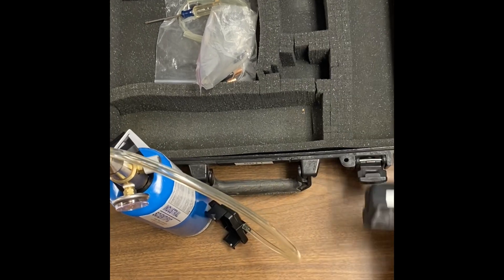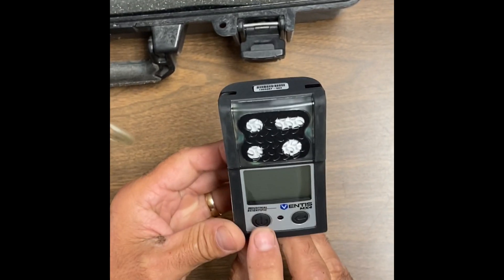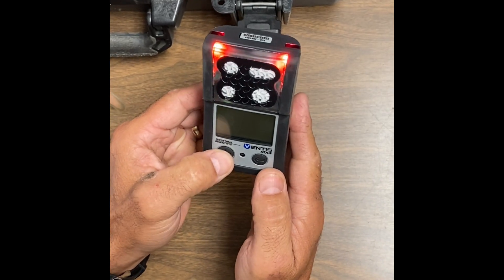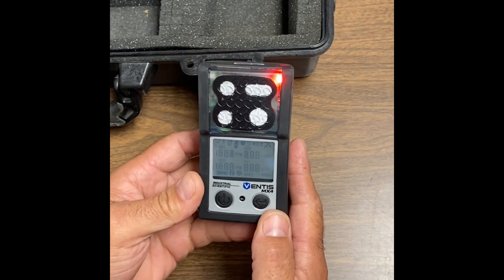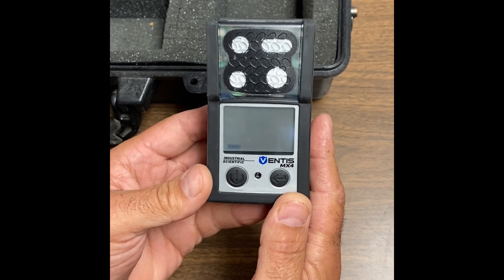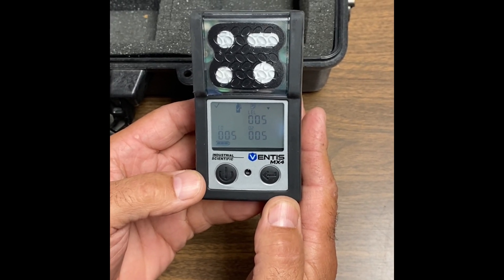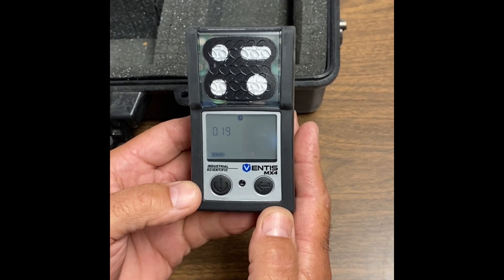Go ahead and grab your gas monitor. This button right here is a mode button, and this button, this arrow button right here, is your enter button. You want to go ahead and hold down the mode button. You're going to hear a beep — just hold it down for a few seconds. Go ahead and let it go, and you'll see it go through its kind of a self-check procedure.